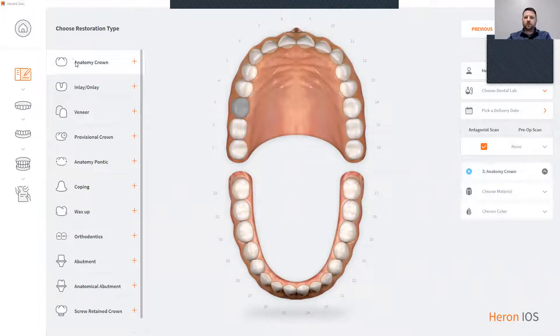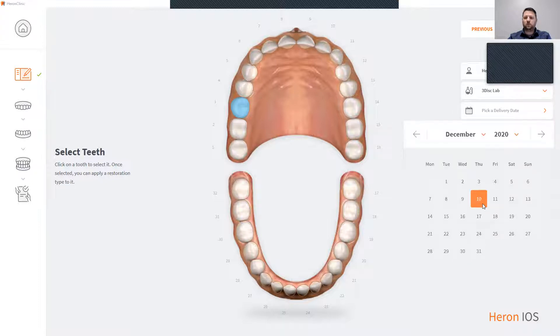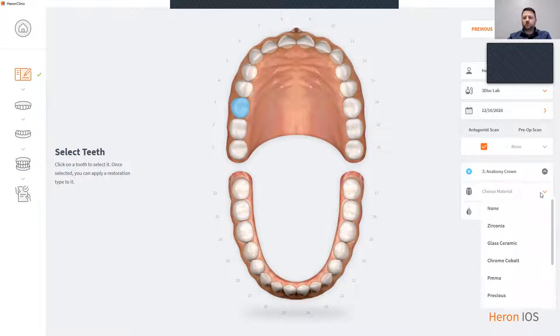We're going to choose anatomy crown. You're going to choose our dental lab and a delivery date. We're now going to choose the material for the crown to be made of and the tooth shape. To start scanning, all you do is simply click next.